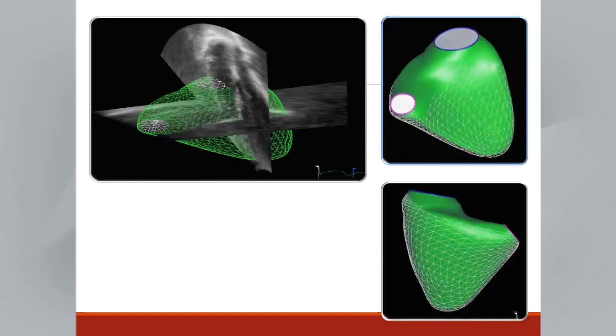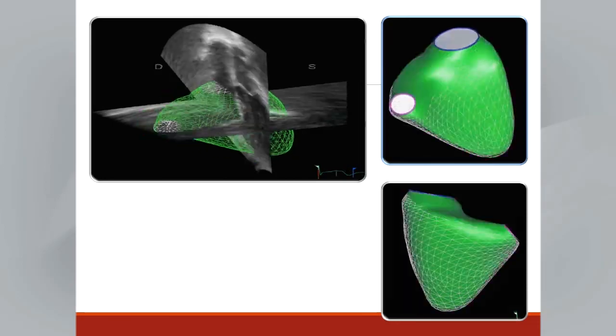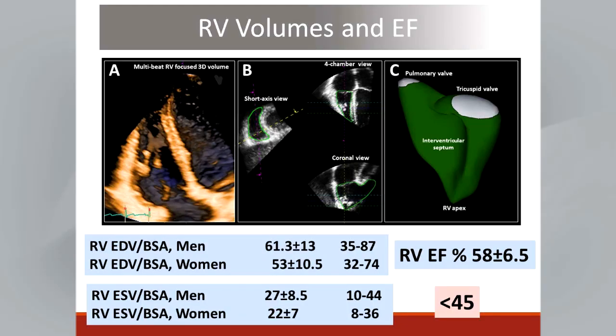The use of three-dimensional echo for the estimation of right ventricular ejection fraction is, in my opinion, of particular clinical value in patients after cardiac surgery, when you don't have a lot of dyssynergic septal shift. After surgery, these conventional indices that measure RV function, like TAPSE or the S-wave, are generally reduced and no longer represent overall right ventricular systolic performance. So this is a way in which right ventricular volumes and ejection fraction can come into play.